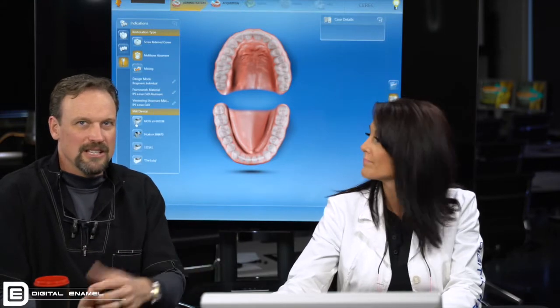Next is your veneering structure, which is kind of a weird term — this is a German program translated into English. Basically the veneering structure is what's going to veneer on top, so it's the crown. Going back a step, the framework material is your abutment — what's the abutment material? So we chose E.max on that as well.